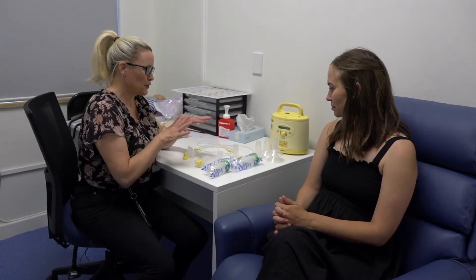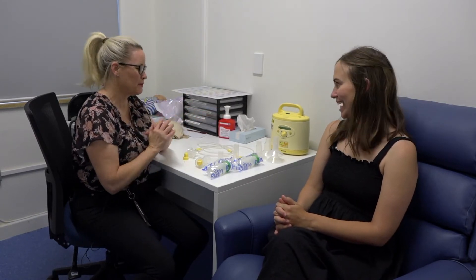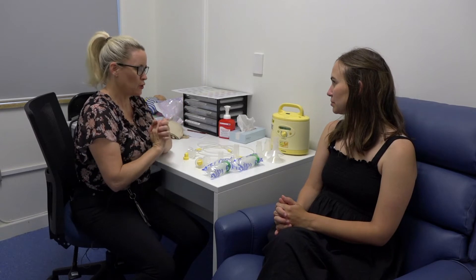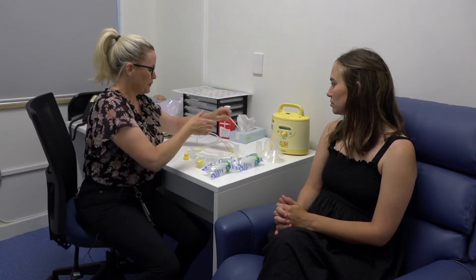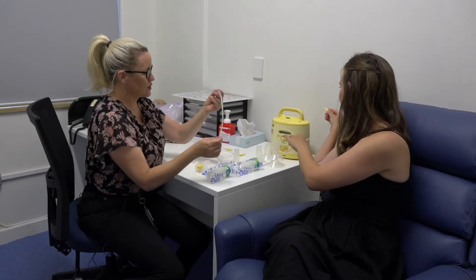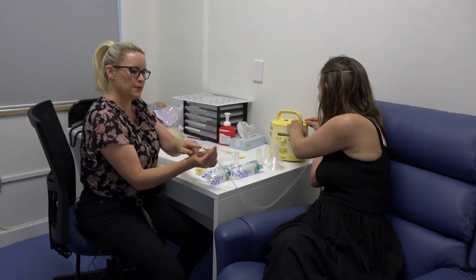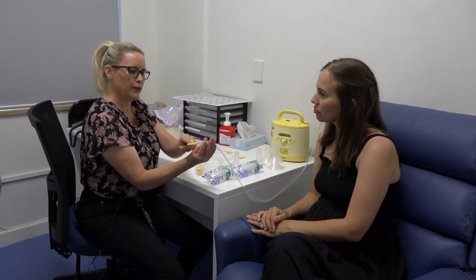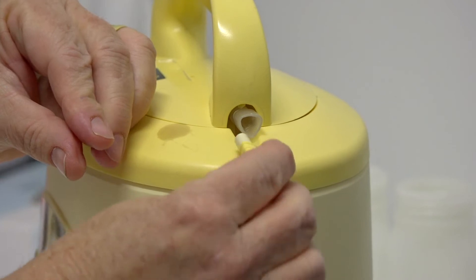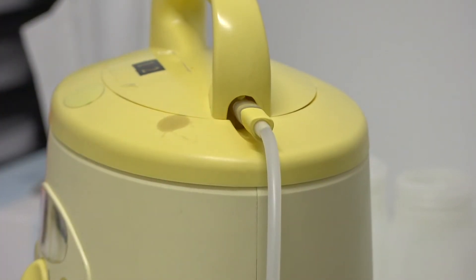Not only do we need clean equipment but clean hands — making sure that you always wash your hands before you start. So then what we need to do: pop the end of the tubing into the connector there. This is the older equipment so it has a bright yellow end piece and it's kind of triangular in shape, so it will only fit into those types of caps and membranes.